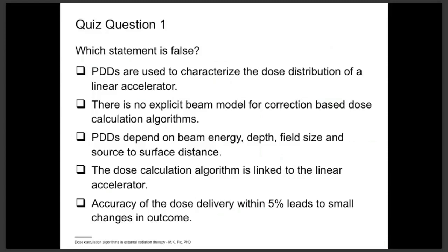This depends a little bit on the beam energy you are looking at. Typically nowadays, many use only 6 MV photon beams, and there the pair production is not that relevant. But still, there are machines out using 18 MV for Varian machines, or even higher energy for Siemens, where the pair production needs to be taken into account.